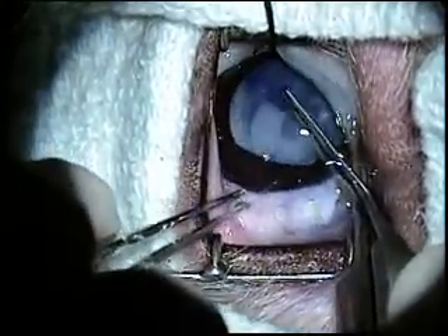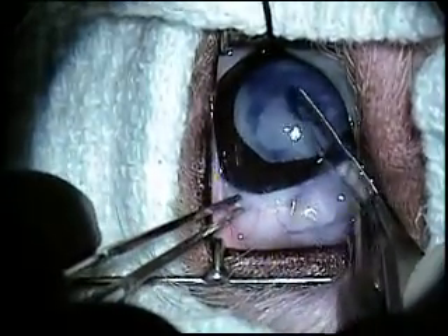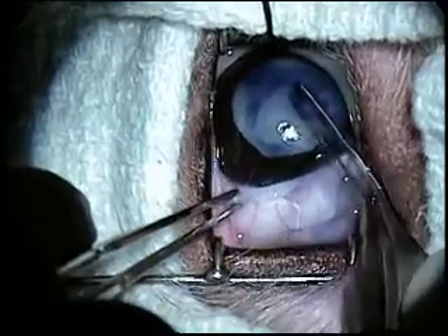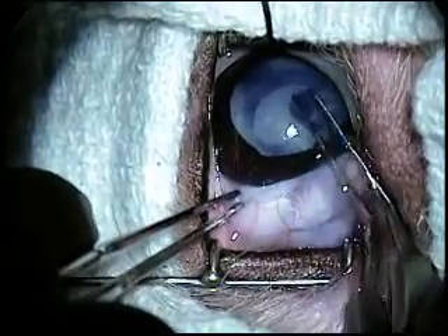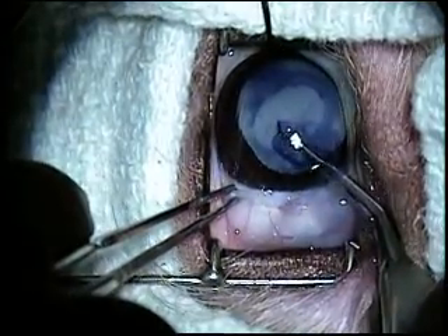Using small intraocular instruments, a window is created in the anterior lens capsule to permit removal of the cataractous lens. A blue dye is used to enhance visualization of the capsule.